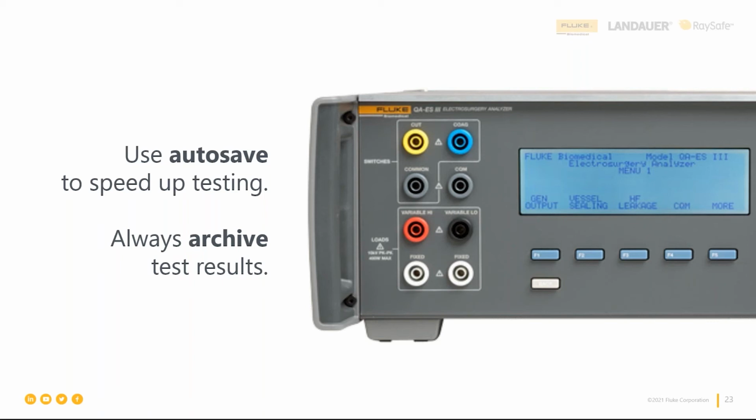QAS3's got a lot of fans. You're going to let the magic blue smoke out of the ESU before you let it out of the QAS3. So if you have to do a lot of testing, like some of these PMs can be kind of lengthy, you can build up a lot of heat in that ESU. Remember, they're only used for a few seconds at a time. So you want to try to minimize that cycle that you're running it to get a stabilized answer.